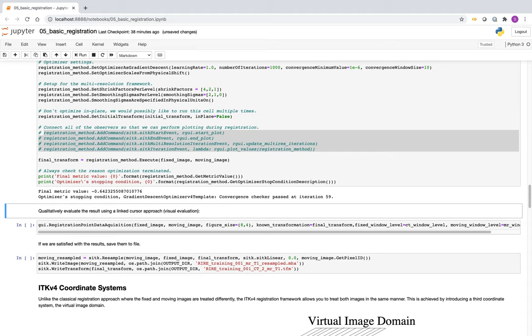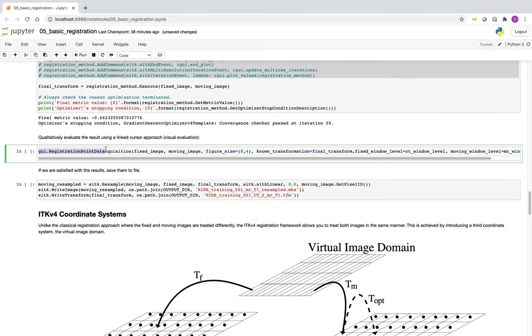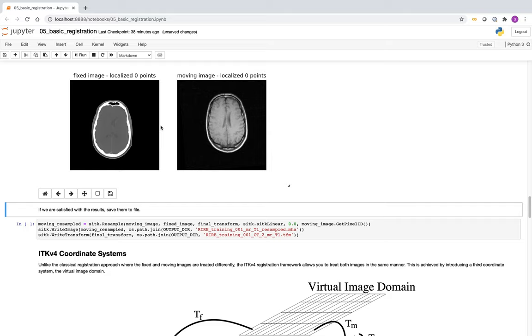This is the typical workflow: start with a simple setup, see that it's going in the right direction, increase the number of iterations, confirm it's still going the right direction, then remove all the observers and just run the registration.